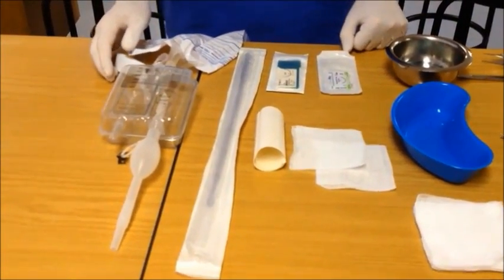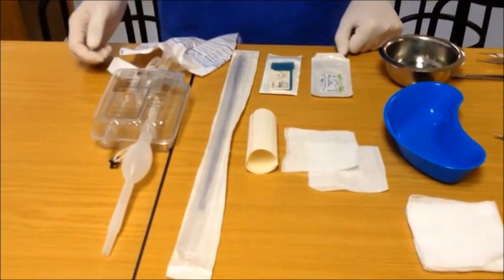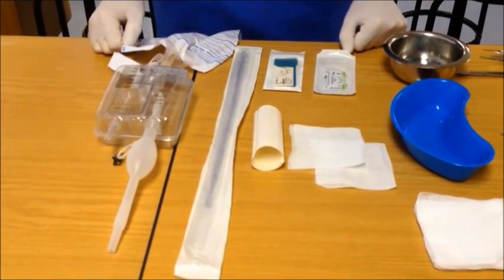You will also need the chest drain itself and a drainage system. There are various drainage systems available on the market ranging from the old underwater drain system to one-way box valve systems. Use whatever you have available in your unit.